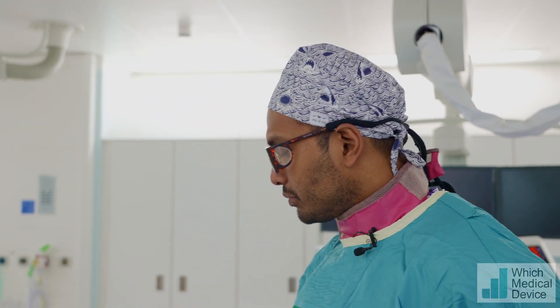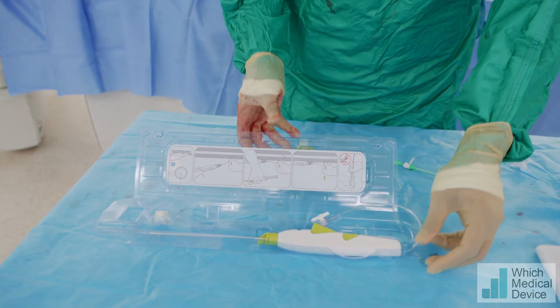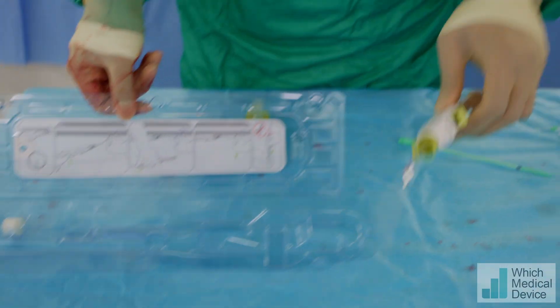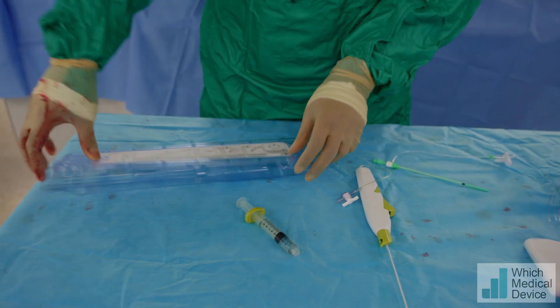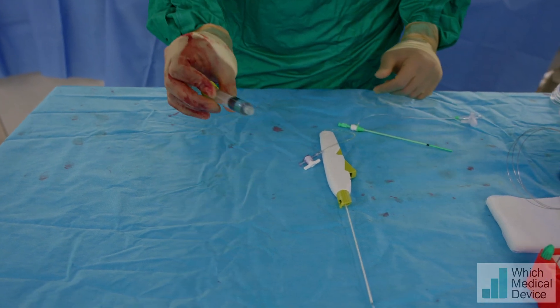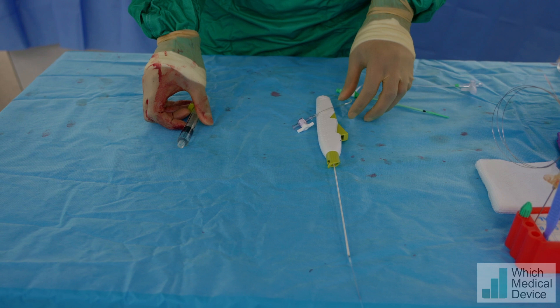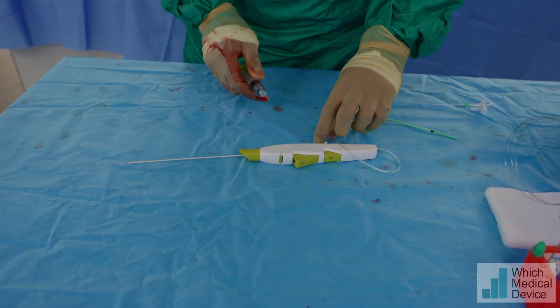We've got a gentleman who just successfully completed an ILAC procedure. I'm going to show you the device and how we're going to use it. When we open the package, the main device comes like this, and then we've got a little syringe that we fill with two mils of contrast and two mils of saline — or four mils of saline, it doesn't really matter. But first we're going to test outside the patient to see if it works.